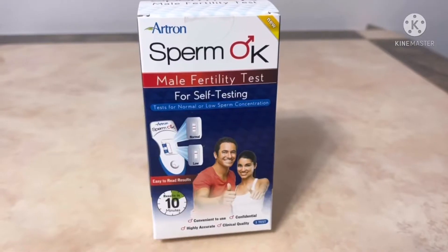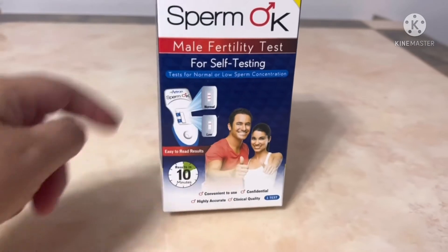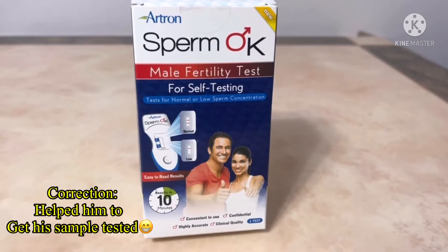Hello everyone, so we're going to unbox something different today. One of my patients — I helped him to perform it — so this is it, I'll show you how.